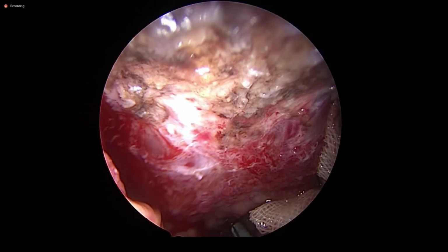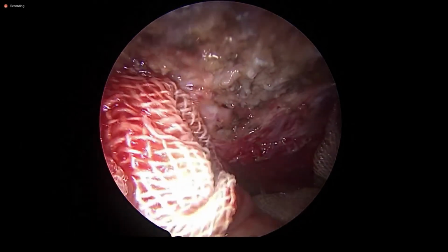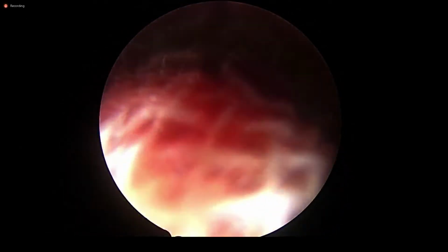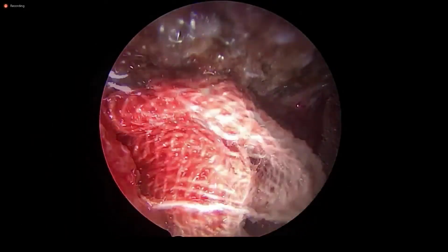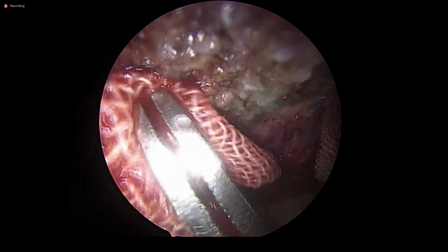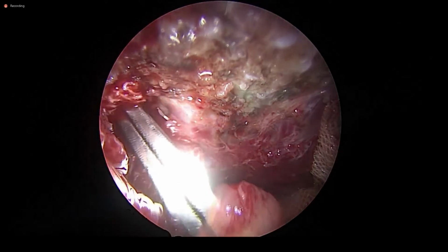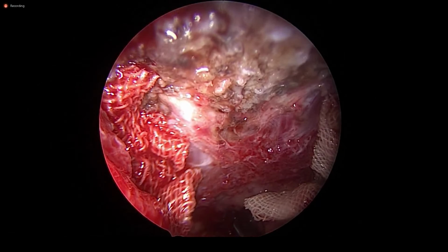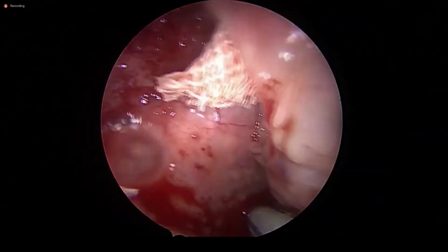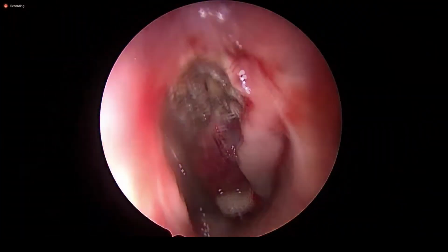You should be careful about this area. You should do it carefully because all junior colleagues are not as skilled. That is a very important area, you have to be safe and follow the protocol. If you have no angled endoscope, sometimes you will land in trouble and it will be very difficult. I'm Dr. Tushar Gandhi from Kolkata.